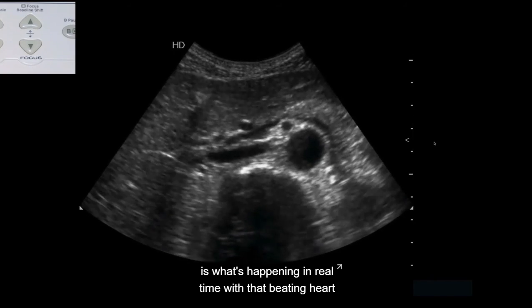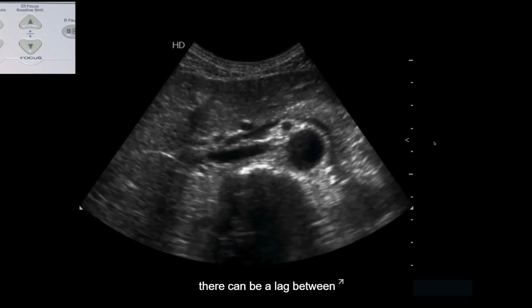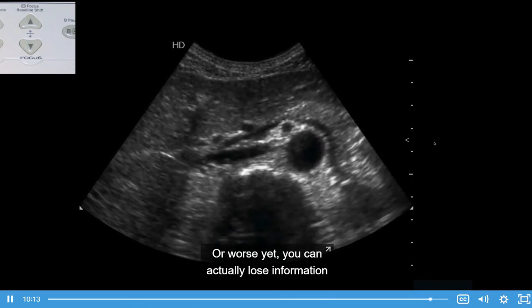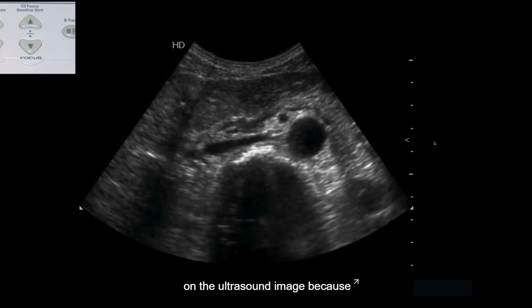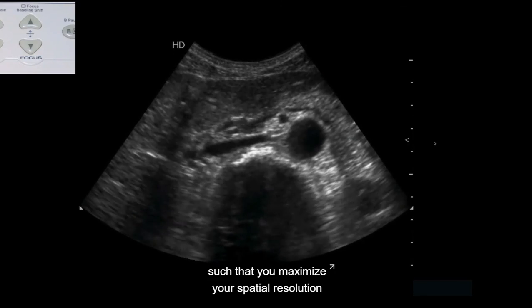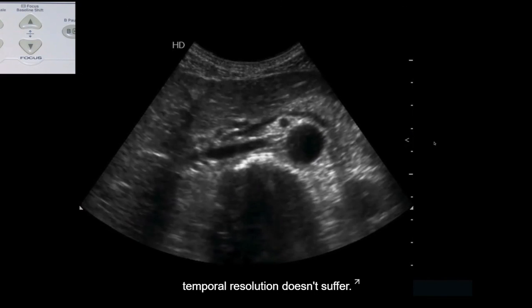Is what's happening in real time with that beating heart being displayed in real time on the ultrasound image? If your frame rate is too low, there can be a lag between what's happening in real time and what's being displayed on the image. Or worse yet, you can actually lose information in time of what's happening in a real patient on the ultrasound image because your frame rate is too low. So you need to use your focal zones judiciously such that you maximize your spatial resolution and improve that, but that your temporal resolution doesn't suffer.